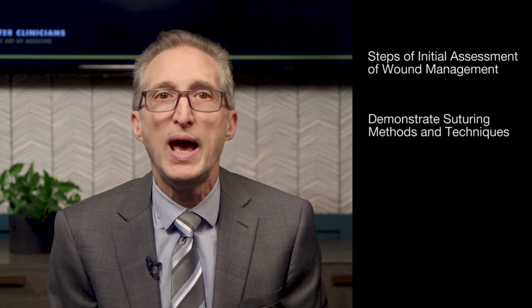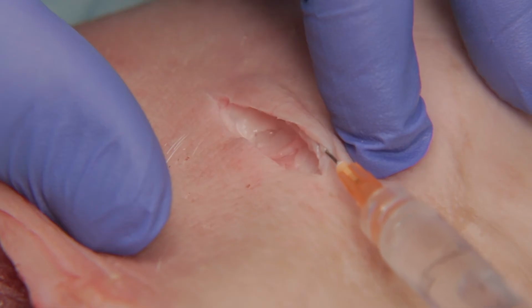Today, we will review the steps of initial assessment of wound management, demonstrate various suturing methods and techniques, and alternative closure methods like wound staples and tissue adhesive glue. The following objectives will be met by the end of this course. You will learn different approaches to laceration repair closure. You'll learn anesthesia techniques depending on the wound presentation.